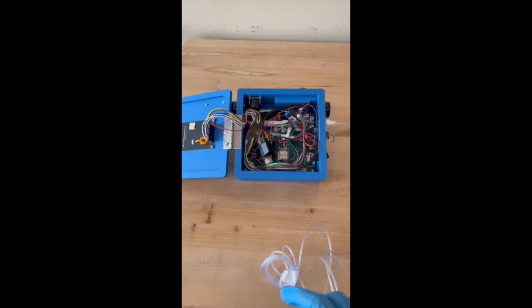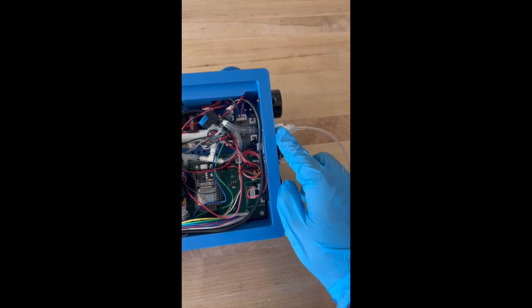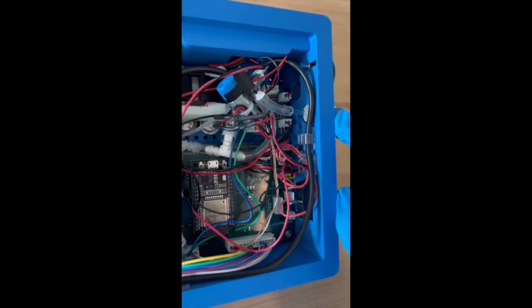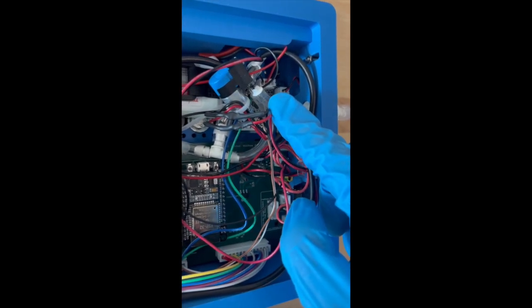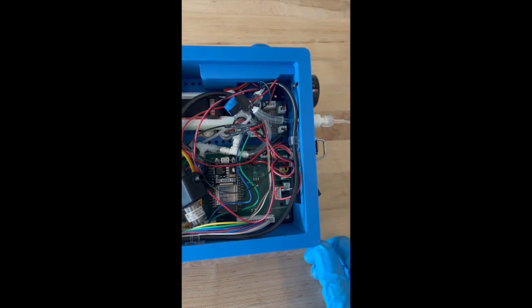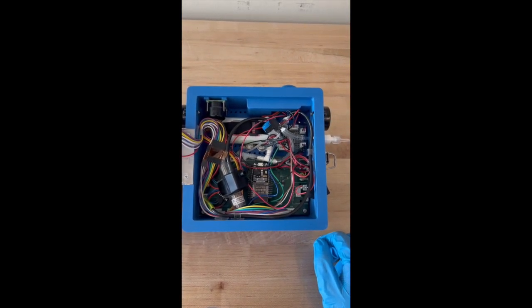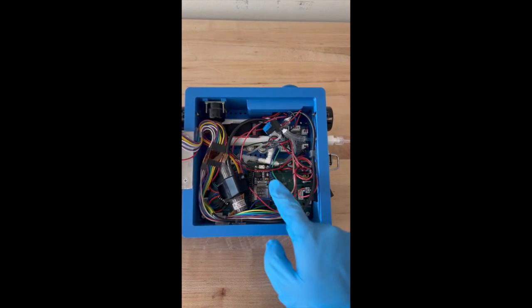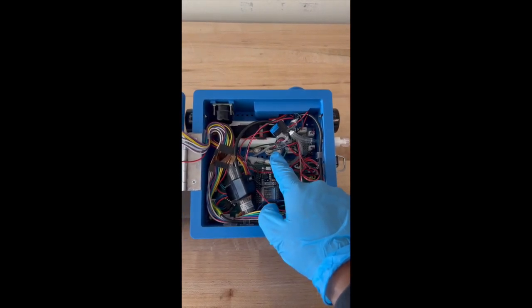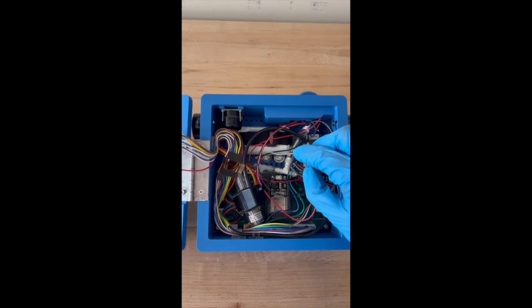It features the PCB, all the electronic connections, and the pneumatic workflow, which begins from the luer lock connector that goes to the bacterial filter that stops condensation from entering our line, and then air is sucked in through the diaphragm pump that we have, which then goes to the RH and temp sensor that enables us to tell if there's condensation in the line, as seen by that T over there. Behind the pump, which you can pull back to view.